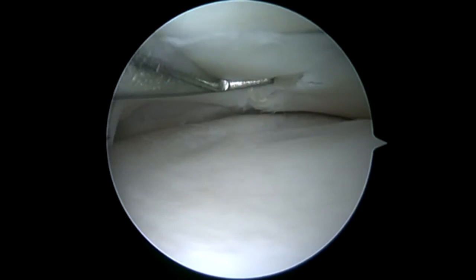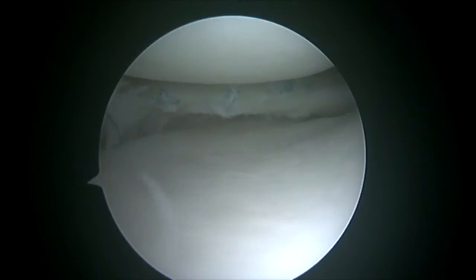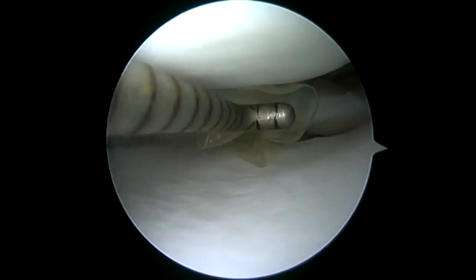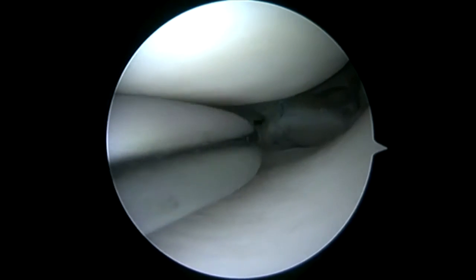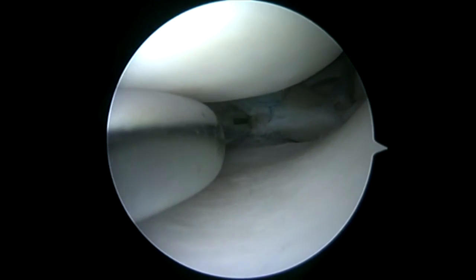In this case I just use my grasper to push it through. Here I've gone ahead and repaired with my Nova Stitch Plus. I've got my barrel stitches in the middle one-third. I would like to have grafted the middle one-third with the CMI implant, but the insurance won't approve it. So for that defect where I had to split open the meniscus after I sutured it, I'm going to shove this amniotic membrane wrap into the meniscus to aid in its healing. This is going to seed it out with growth factors. This is the blunt end of my knife with the blade off to give me a nice low-profile pusher to dock this into that meniscus.